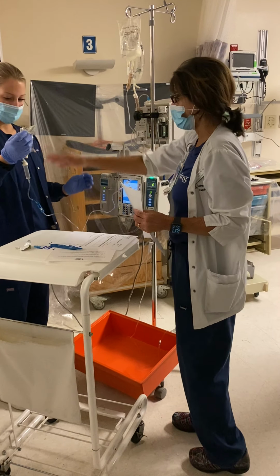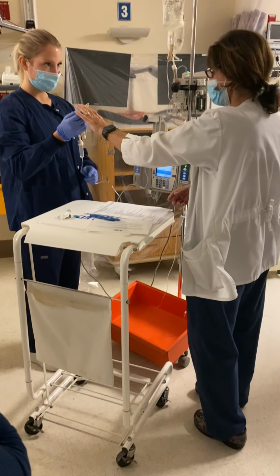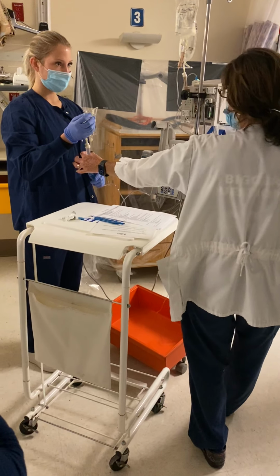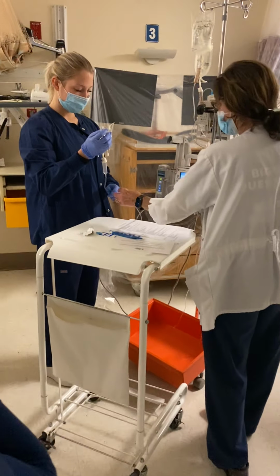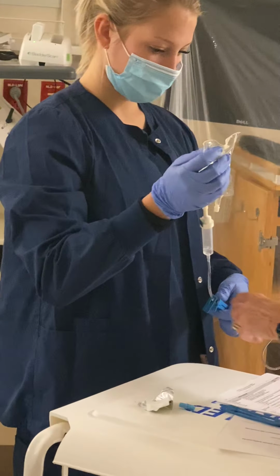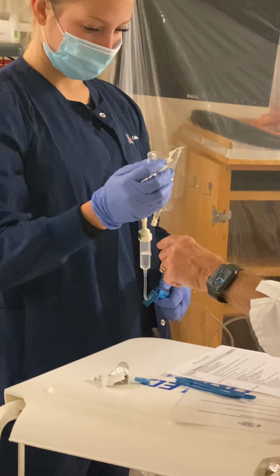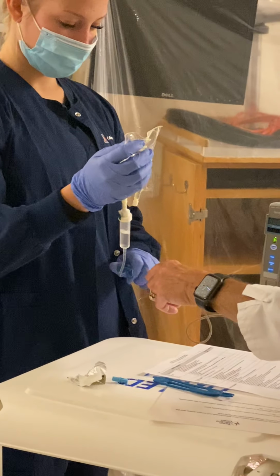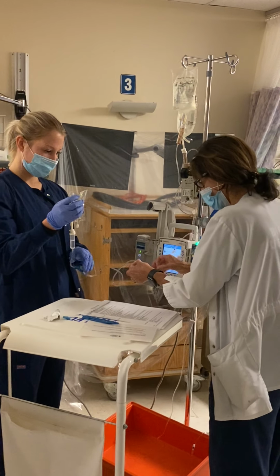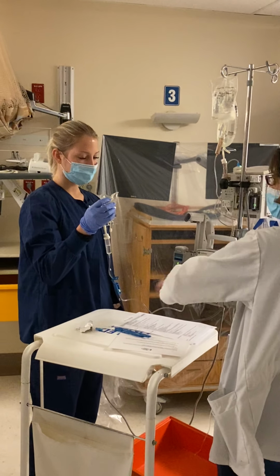Again, remember this bag has to be lower than the primary bag to back prime. I recommend exactly how you're holding it. Some students hold it down at an angle and you can't see the drip chamber being full. So remember you're going to open up the clamp all the way, and this fluid is going to back prime, there we go, only enough to get to at least half or a little bit more, because we don't want to dilute the new medication. Okay, perfect, just a tiny bubble. That's okay. So now you've back primed.